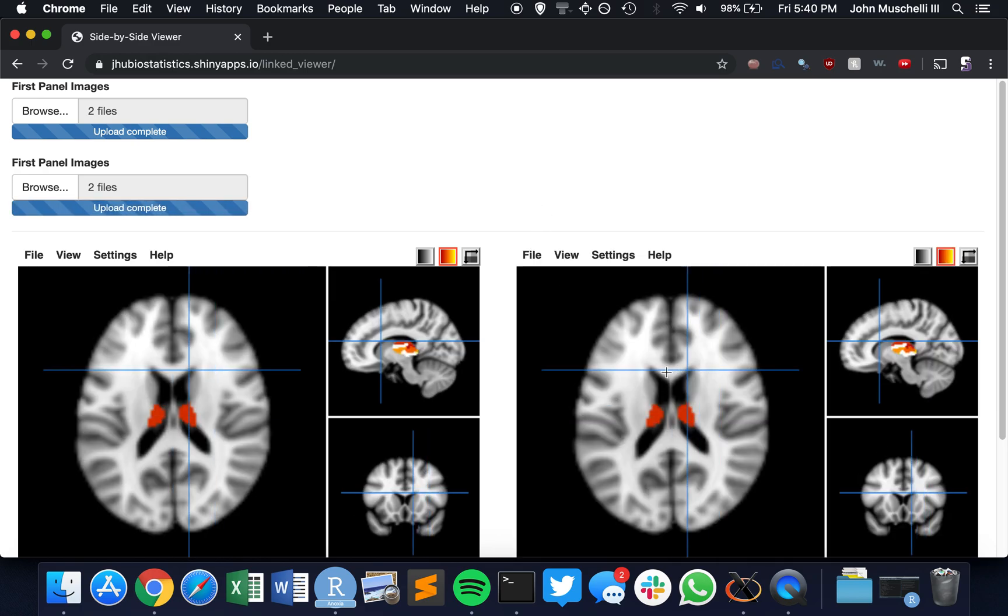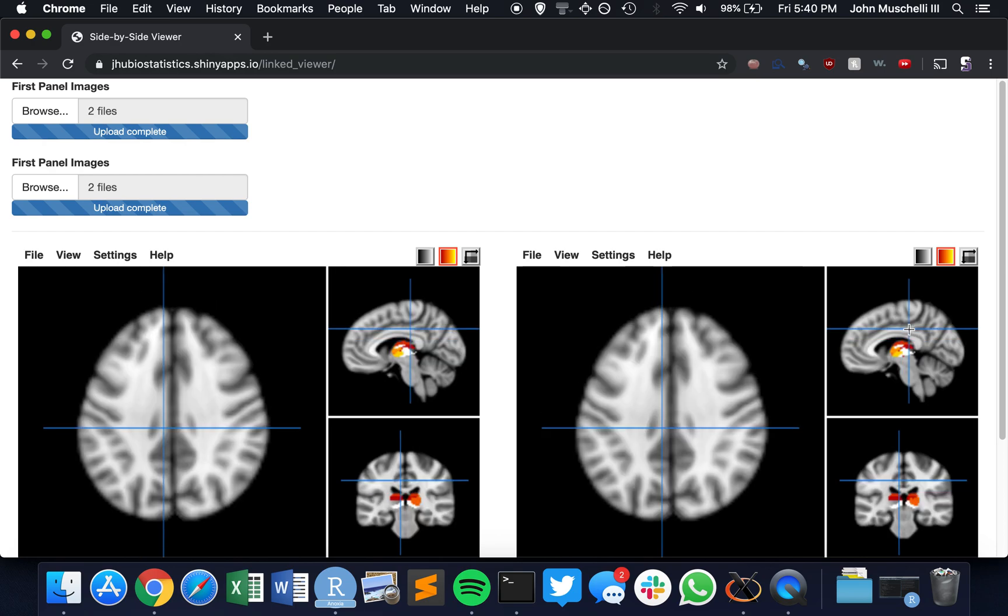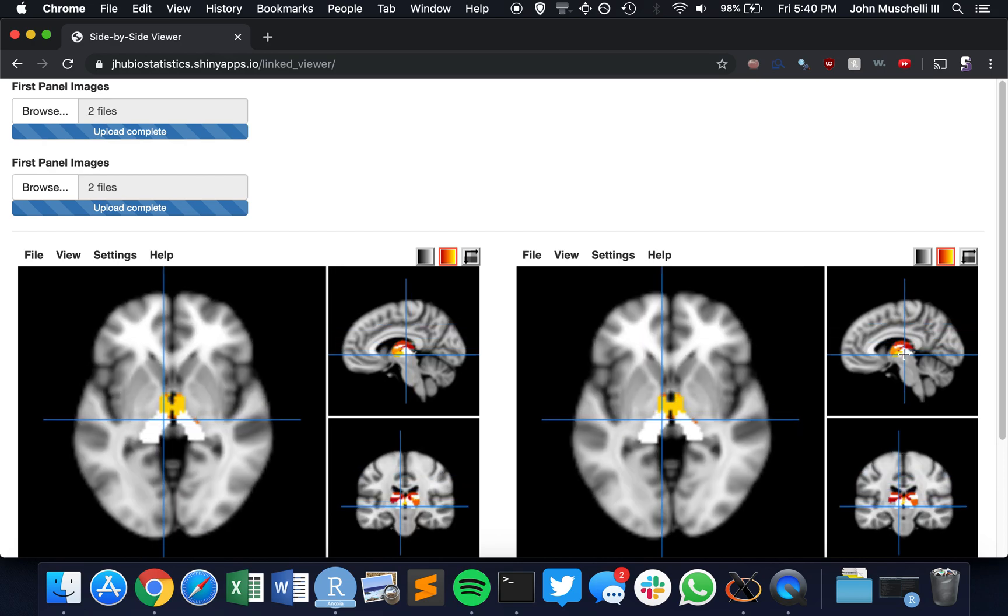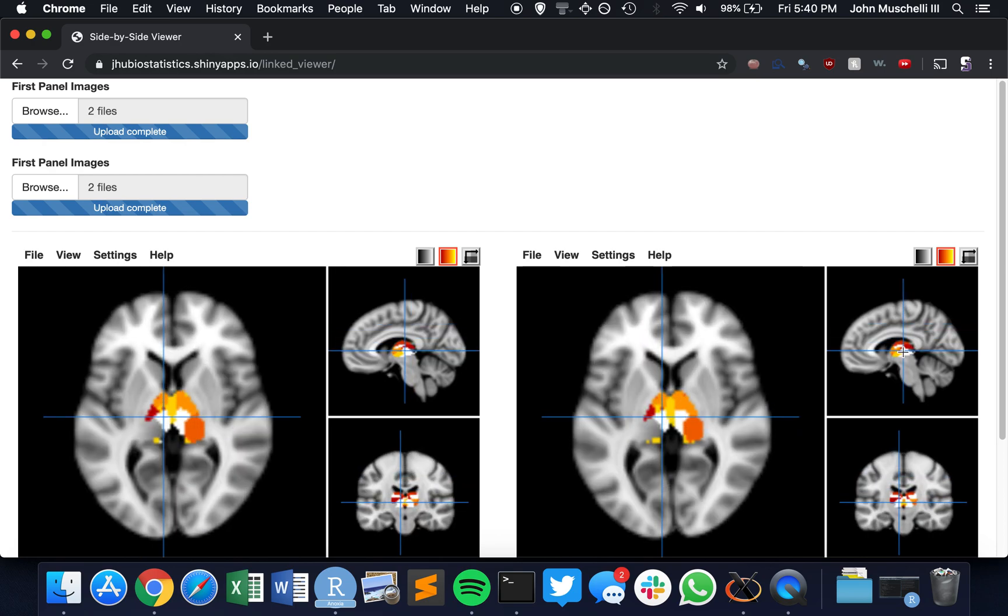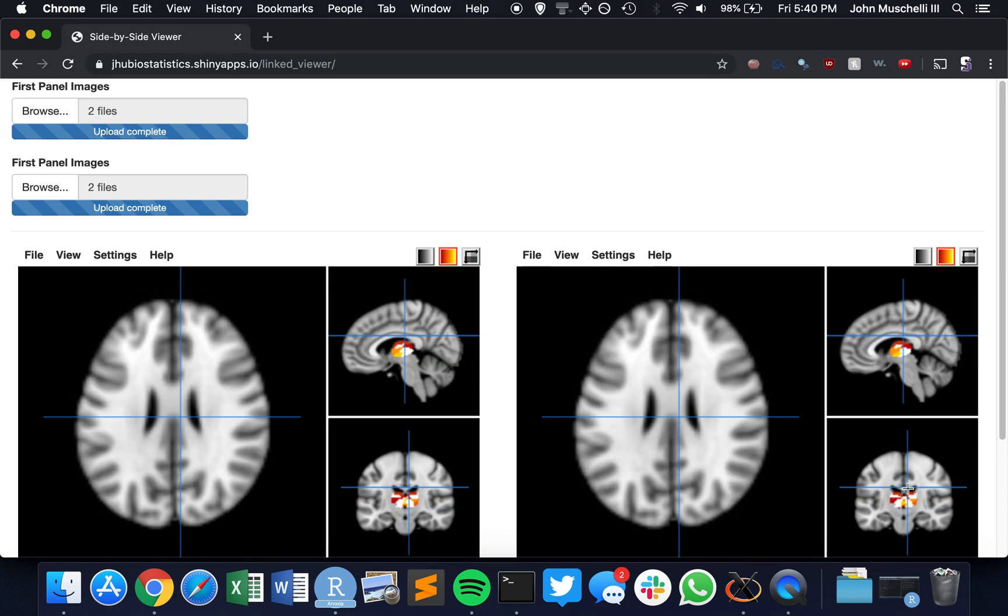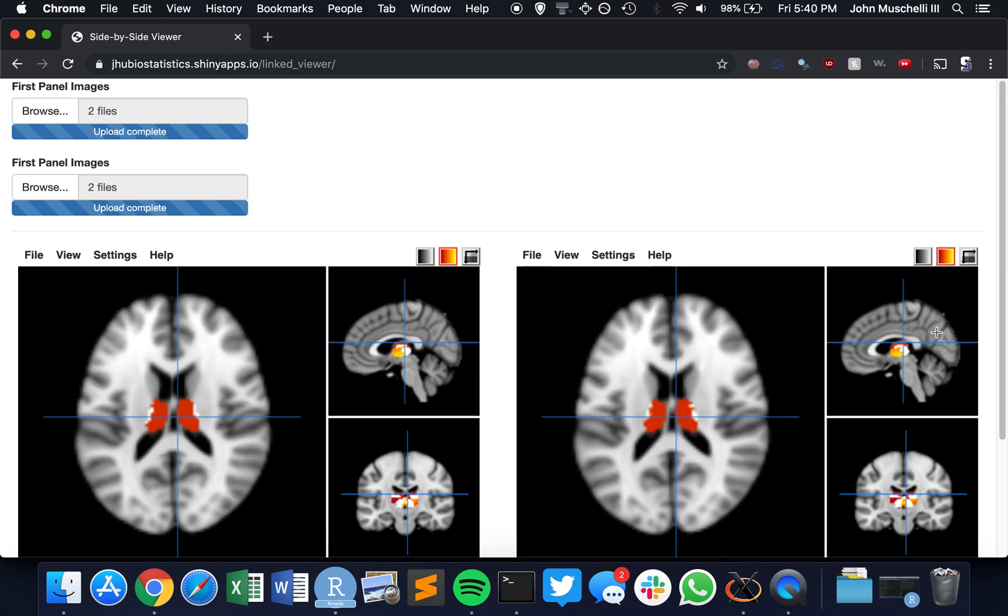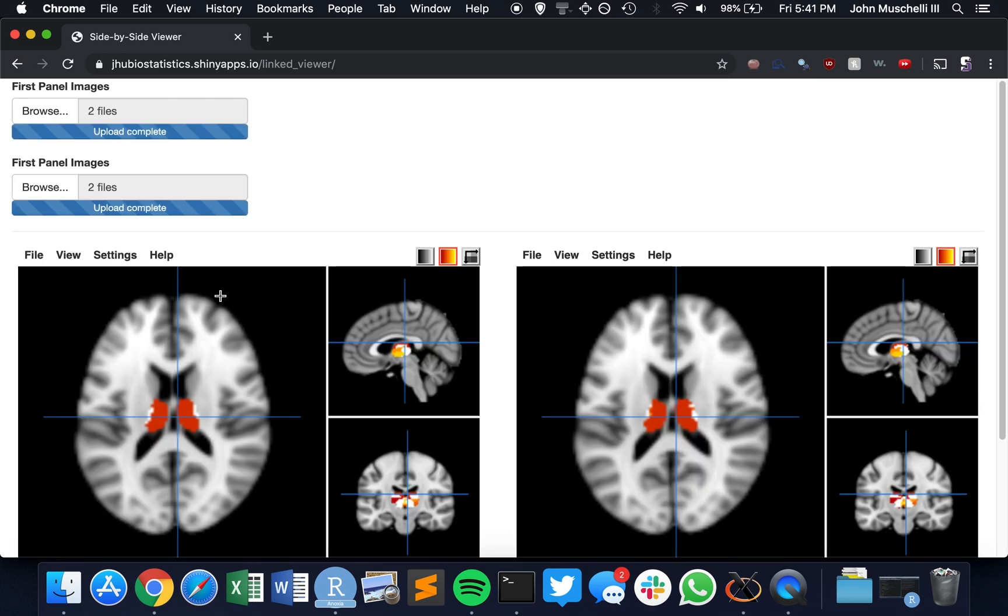So we should see now that the viewers are synced, and we should be able to see differences in the overlays. We can change settings around here with the viewer preferences. We can change anything like we normally would in papaya.